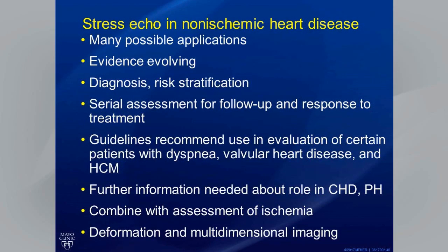So in summary, stress echocardiography is an extraordinarily versatile technique. It has many possible applications in the patient with non-ischemic heart disease. Our evidence is still evolving, but I think this technique is ready for clinical practice and application to some of our most challenging patients. It can be used for diagnosis as well as risk stratification. It lends itself to serial assessment for follow-up and evaluating response to treatment.